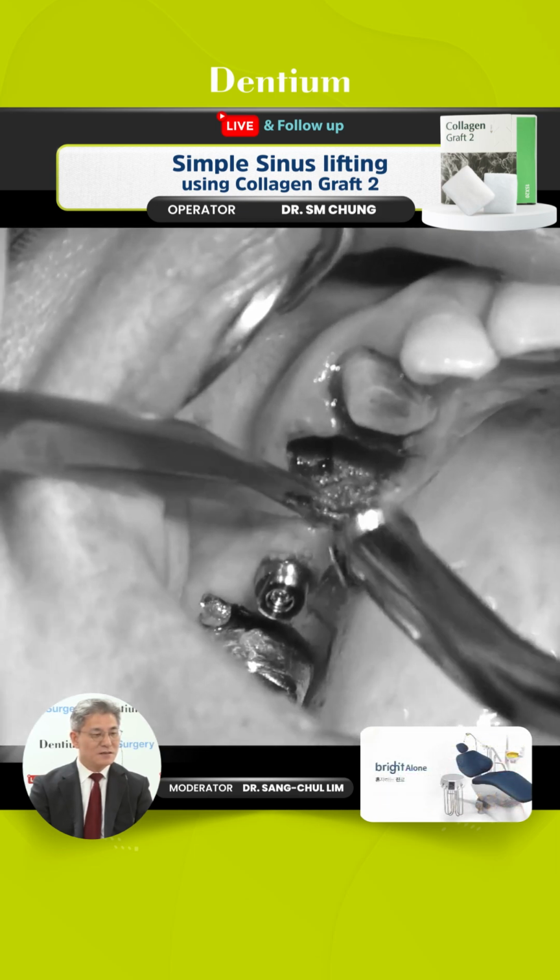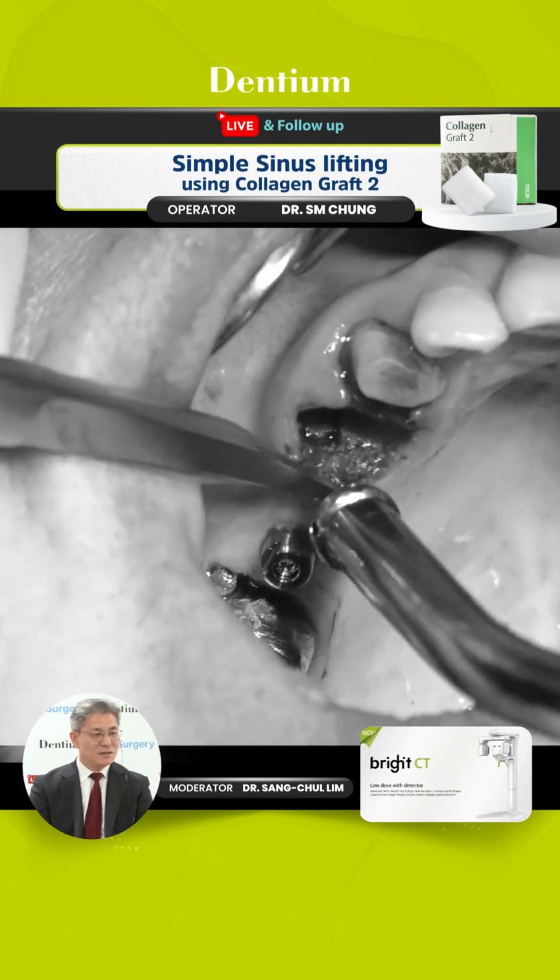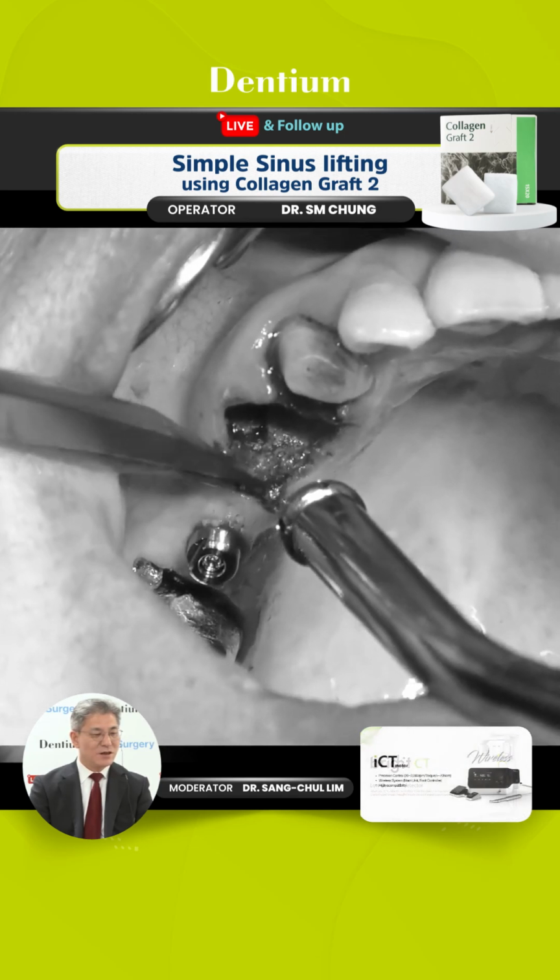Okay, so fast. The installation about this 16 area.